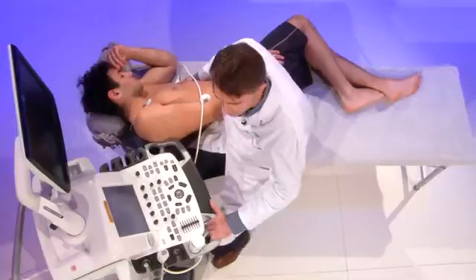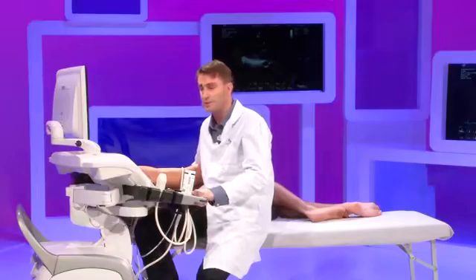One last remark before starting. Ultrasound machines need maintenance. So if you have a machine which is more than 10 years old, the probe is worn down and your echo quality cannot be optimal. So at least once a year you need to maintain your echo machine.